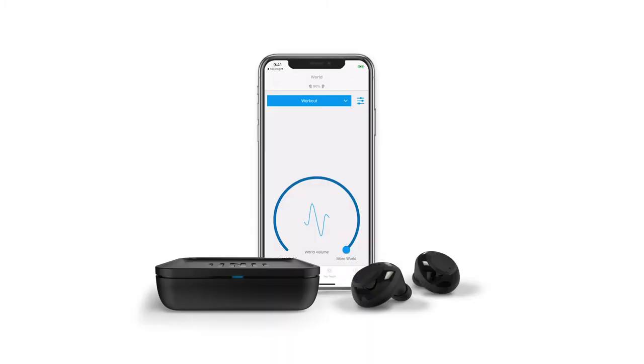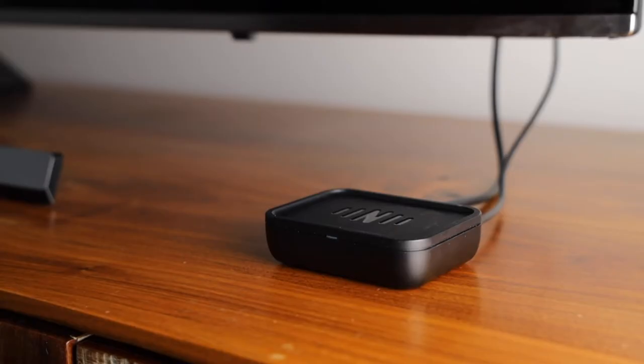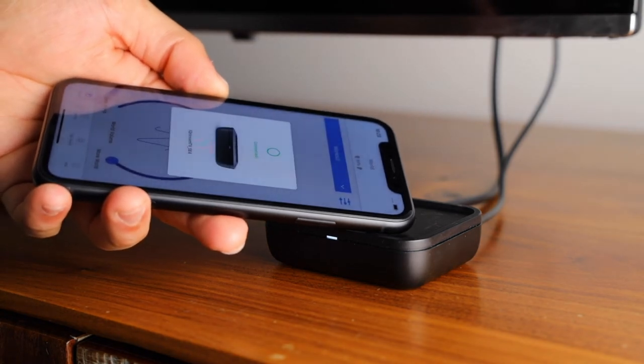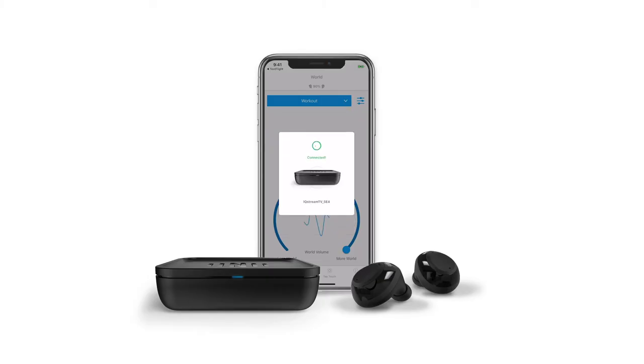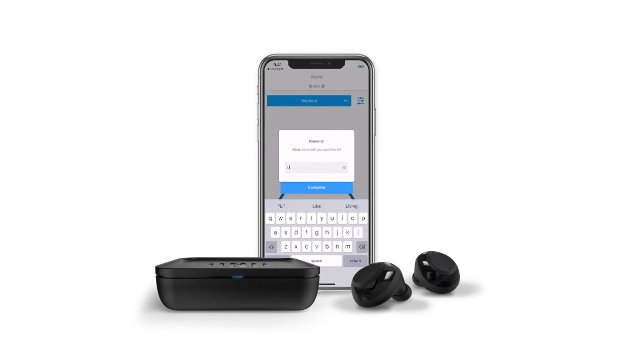When your IQ Buds Boost are connected to your phone, you will receive a pop-up message requesting you to tap your phone on the IQ Stream. Hold your phone or tablet on the IQ Stream until you see 'connected'. If you didn't see this pop-up, you may need to update your app. Go to the app store on your phone or tablet to do this. Choose a name for your IQ Stream — whatever room you are in is a great name to use. Your IQ Stream is now ready for use.